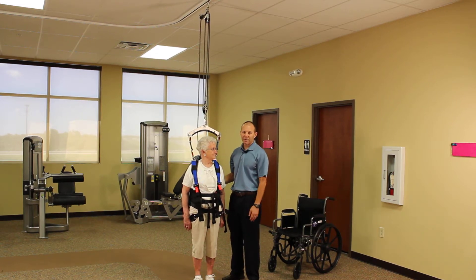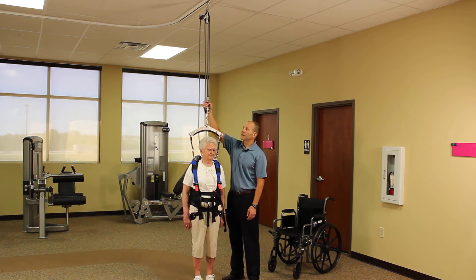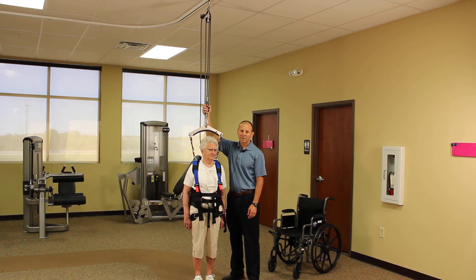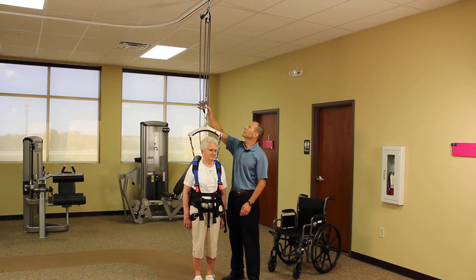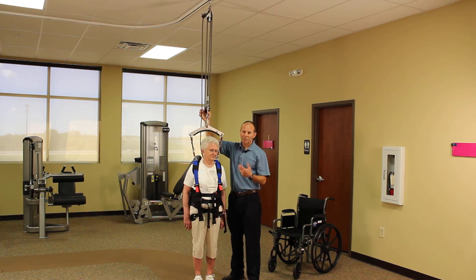I want to cover an important safety aspect of using the system. If a patient were to become incapacitated, there can be a lot of tension that will develop in the pulley system itself and can make it harder to disengage the cam cleat up on the upper pulley. So in those cases, there's a couple things we can do.